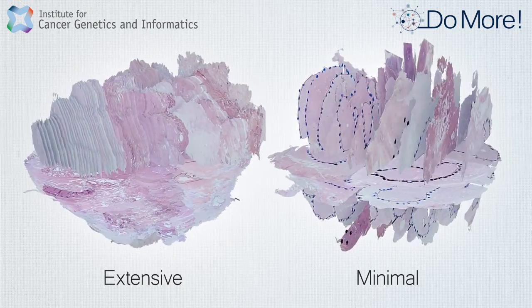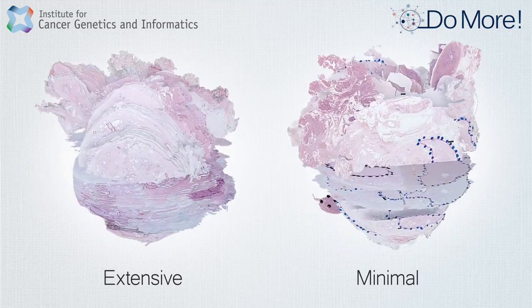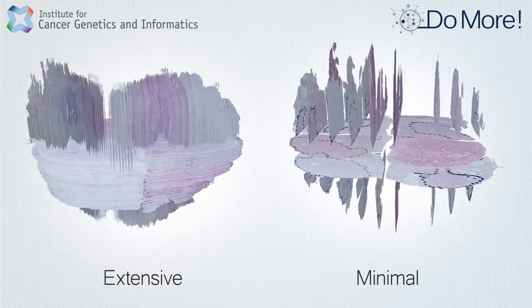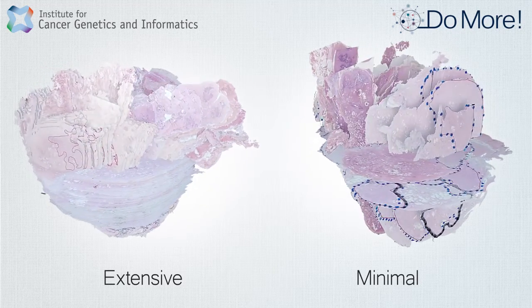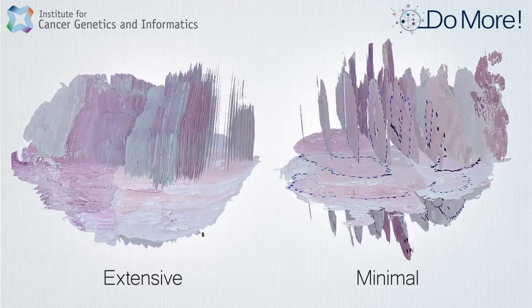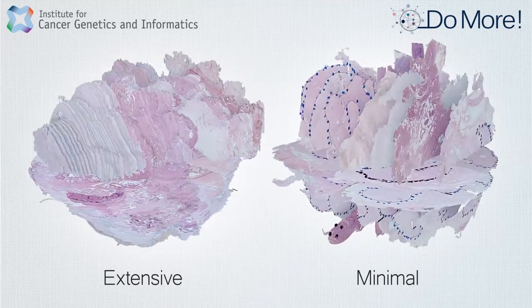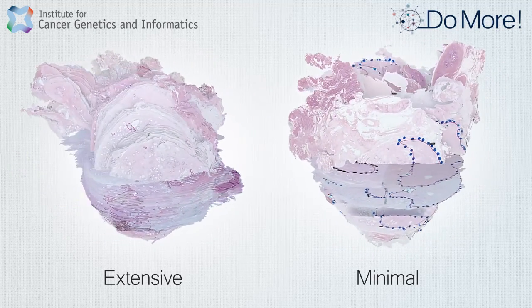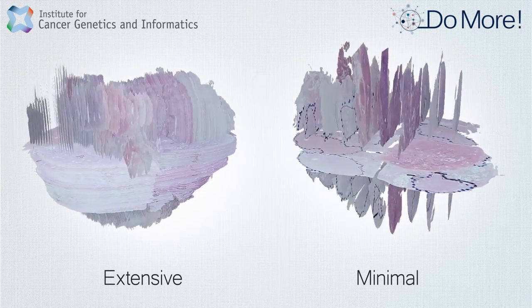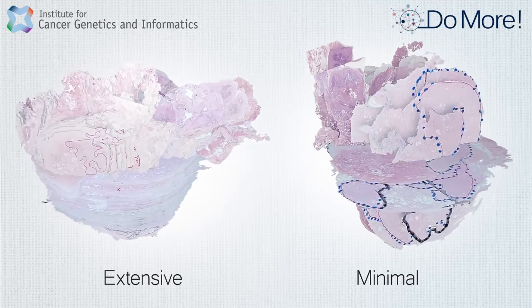There are 2 types of model. The minimal models are reconstructed using 1 section from each tissue block. The extensive model is reconstructed using up to 18 sections from each block. The resected prostate specimen yields 47 blocks. The extensive model consists of 464 H&E stained tissue sections from 38 tissue blocks.